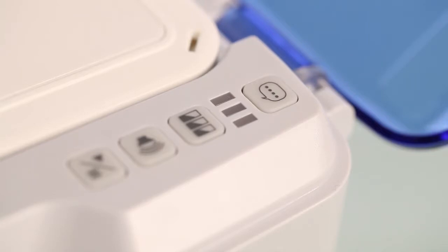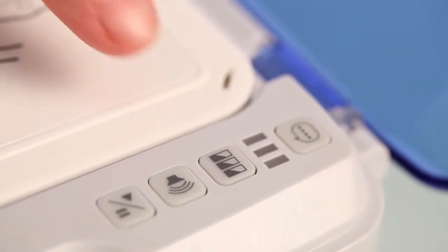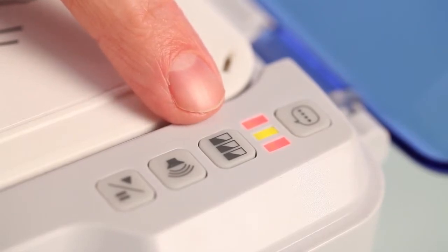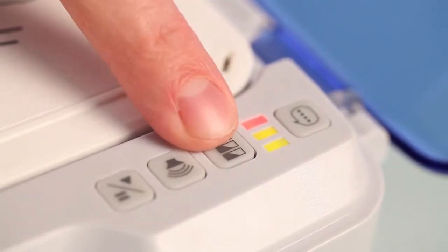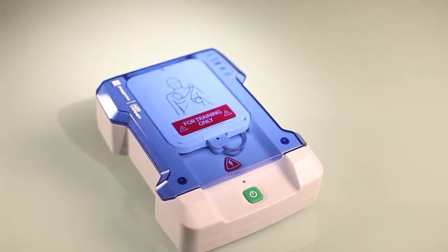Once you have selected the language, the unit will turn itself off. The scenario selection button is used to select one of five scenarios available on the unit. By pushing the button you can change the scenario — for example, shock, no shock, shock. Red means shock, yellow means no shock. No more relying on an index or numbering system that you have to look up or remember.